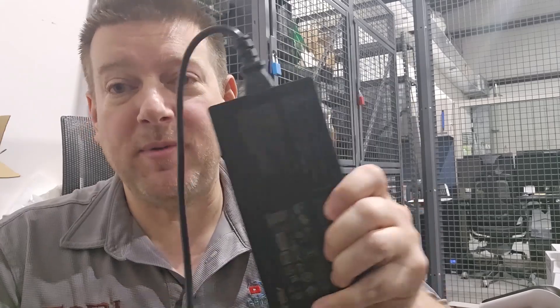Hey everyone, welcome back to Better Biomed. Today I want to talk to you about something that nobody seems to be talking about, and that is your IECs. Now this is a power brick for my laptop, but it still contains an IEC.